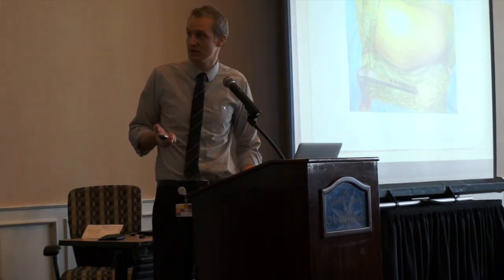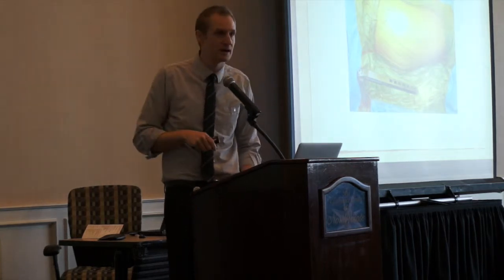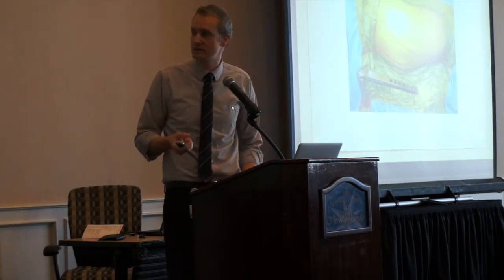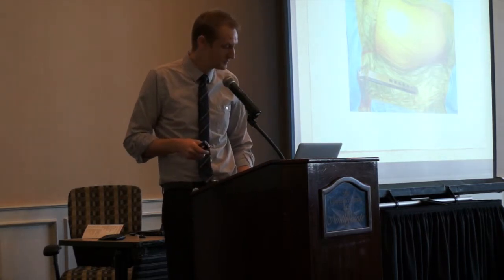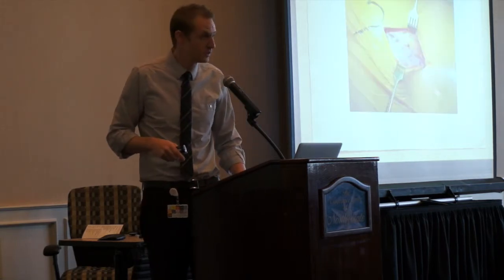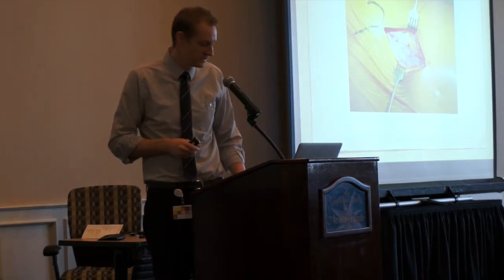This is the patient here, supine on the table. You'll notice the metal device there at the bottom. That's called a femoral elevator. That's something that we use to expose the proximal femur. Here you can see the skin incision. A little bit closer, we're looking at the fascia that overlies the tensor fasciae lata muscle.